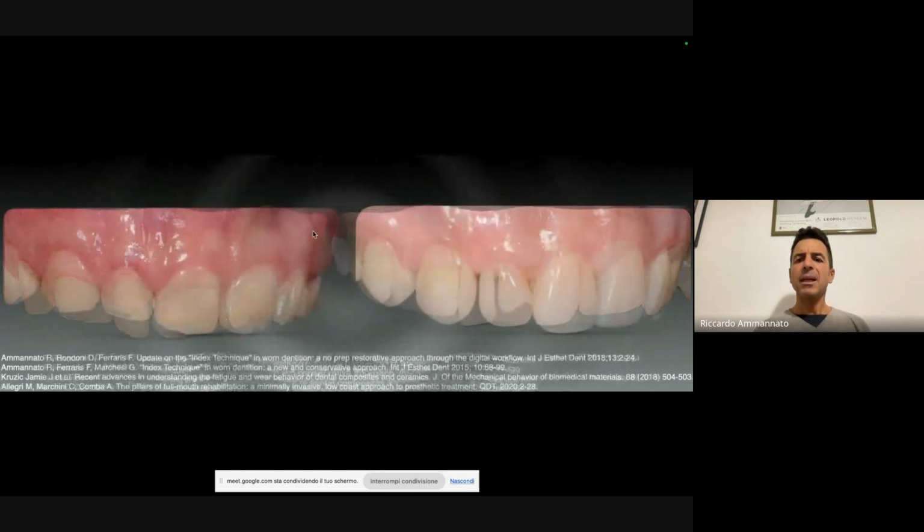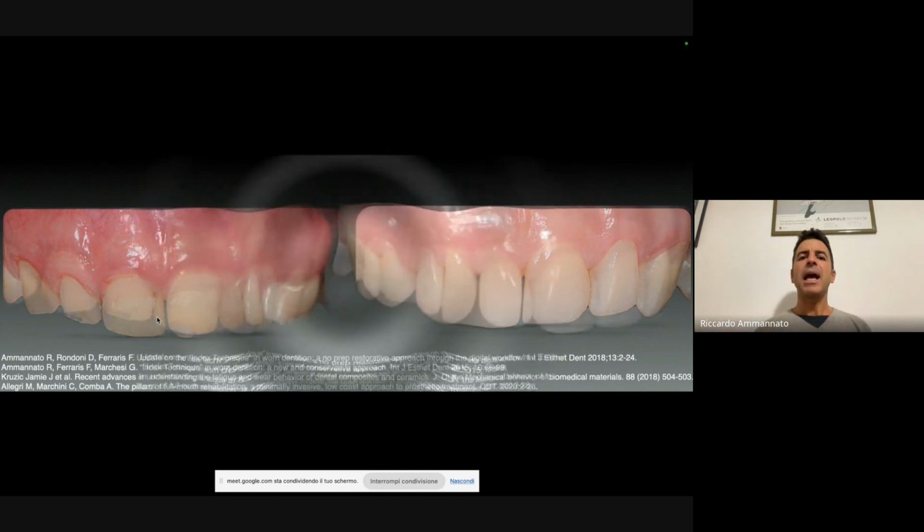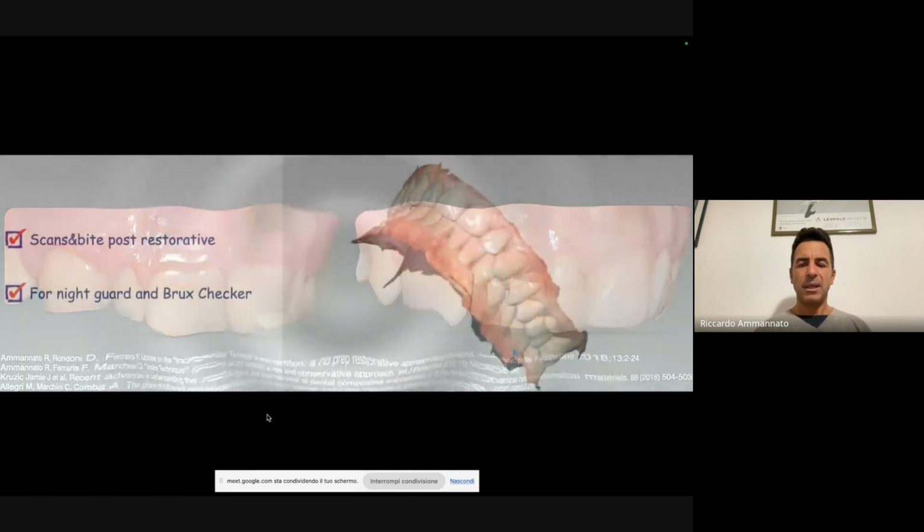Sorry, I just stepped back, the frontal view. This was the initial, and this is after. Again, the patient wanted to maintain his diastema. This was his desire. And here again on this perspective, lateral view, you can see my Emax restoration, and this is the molding procedure.